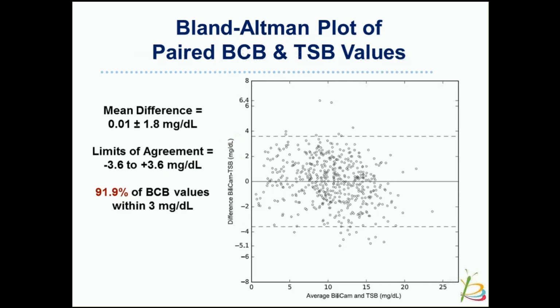They calculated that 92% of the BiliCam bili values were within 3 milligrams per deciliter of the total serum bili. And 73% of the BiliCam bili values are within 2 milligrams per deciliter of the total serum bili.